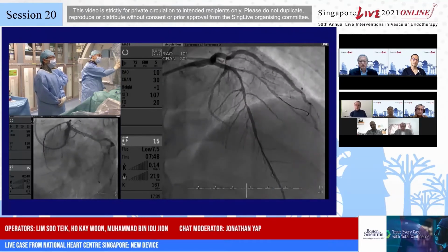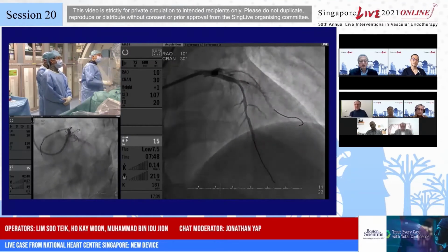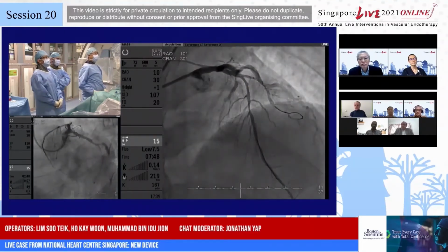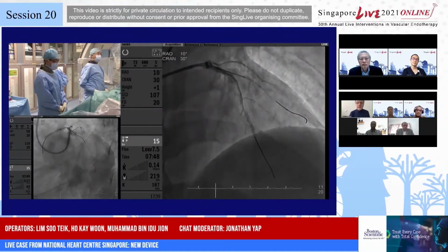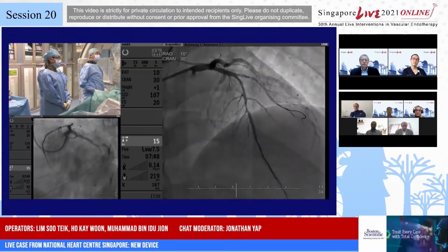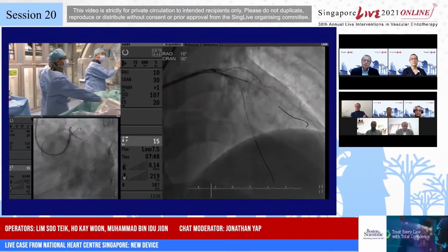This is a way to limit the stent length, preserve side branches, and be safe, because if you measure the residual pressure gradient and the fractional flow reserve, you have some guarantee against early occlusion. Yes, thanks, Antonio.